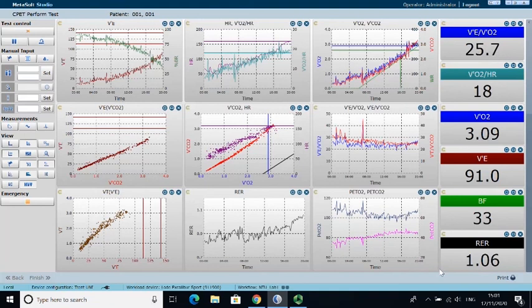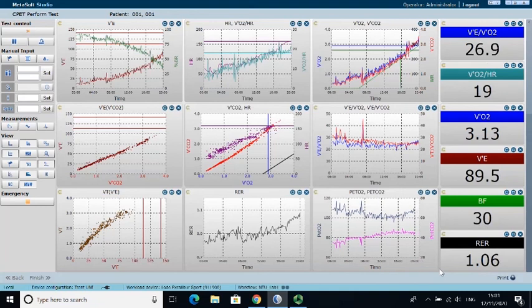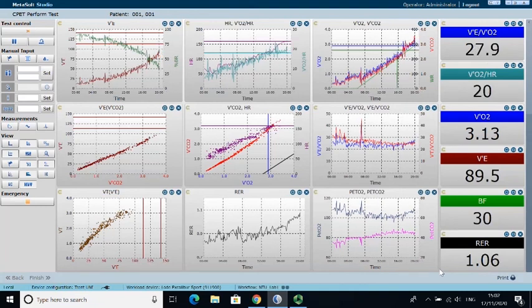Because one of the great things about using these pieces of kit is that I don't have to worry about this stuff getting collected. I've not got to worry about turning a Douglas bag in or out, or remembering to take a heart rate measurement or anything like that. I'm just focusing on them and pushing them so that I can get as best I can a maximal test that's going to be representative of their actual values.